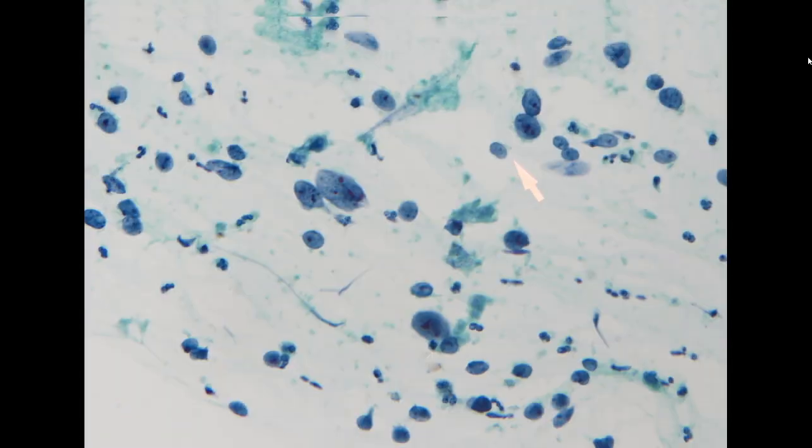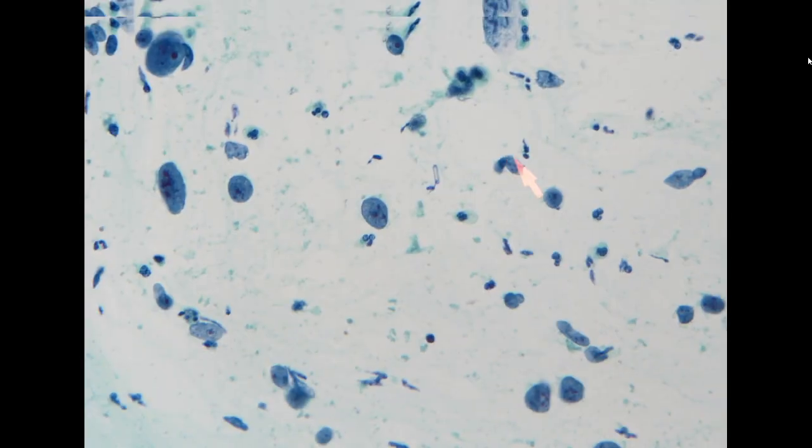So this is positive for carcinoma. And we already know the patient has persistent disease in her vagina. So this is positive for carcinoma.